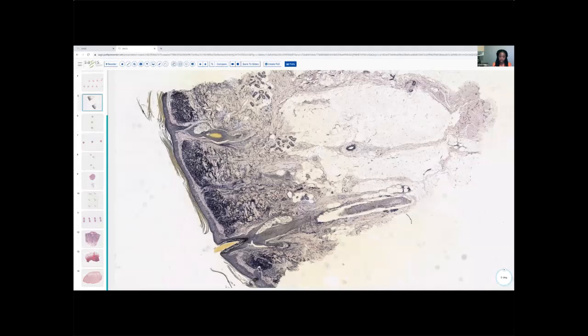And of course, androgenetic alopecia is in the non-scarring category, but with end stage or chronic androgenetic alopecia, you can certainly have or form a scar.